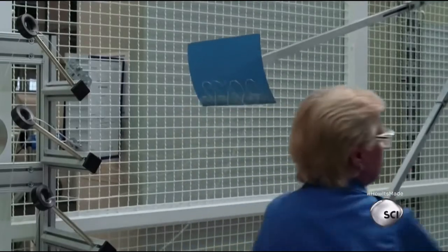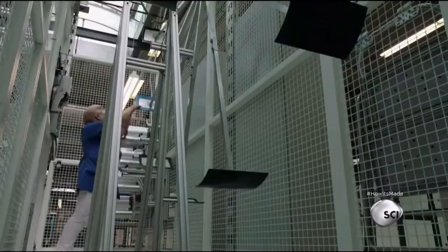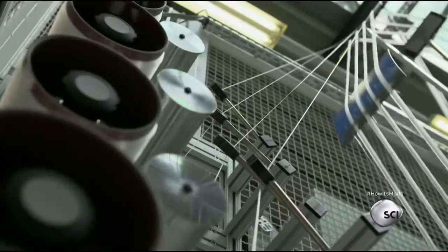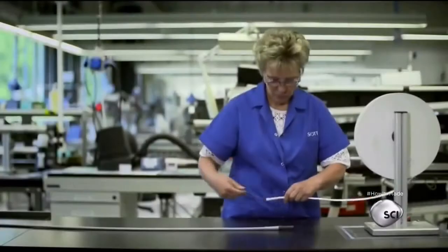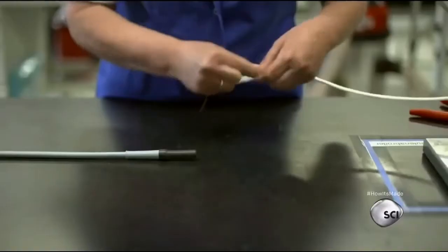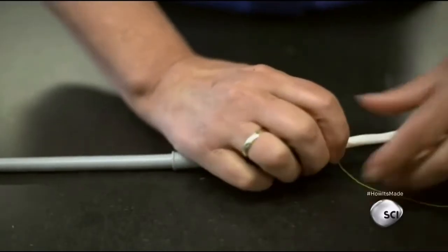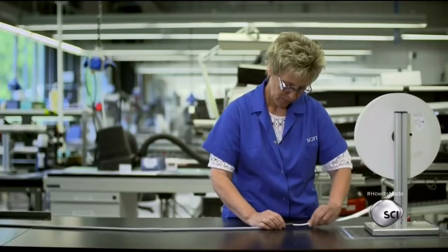A worker combines several single fiber spools onto a large winding wheel to make a bundle containing thousands of fibers. To make the cable that connects a light source in the operating room to the endoscope, a worker inserts an optical fiber bundle into a silicone cable sheathing. This one has nearly 9,000 fibers.